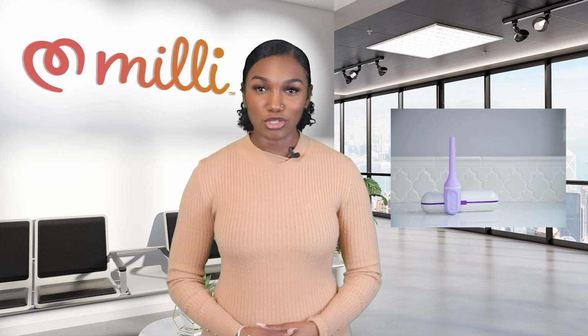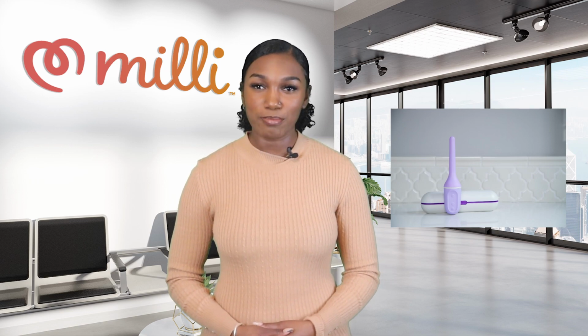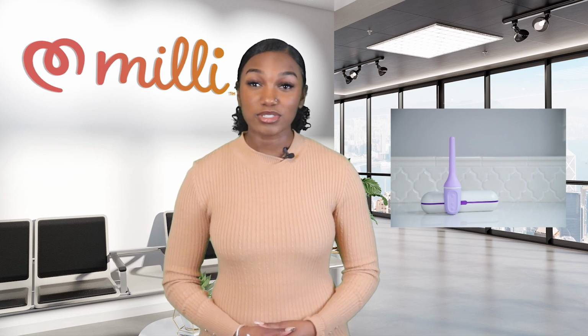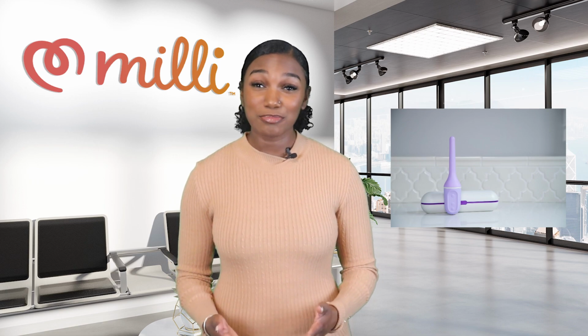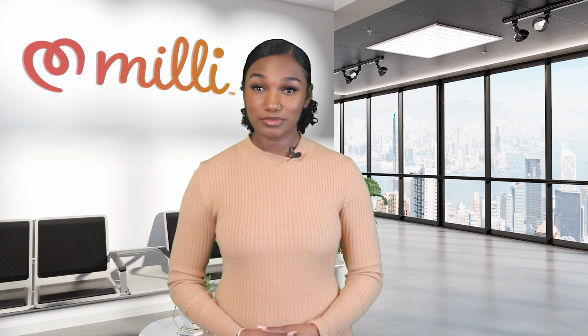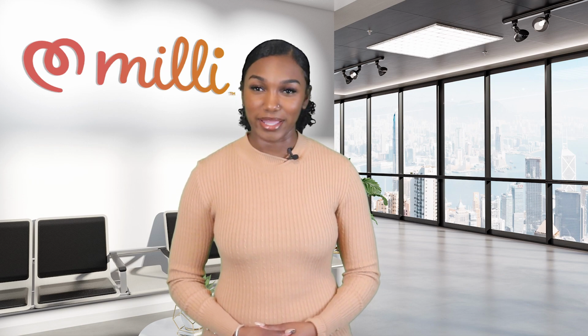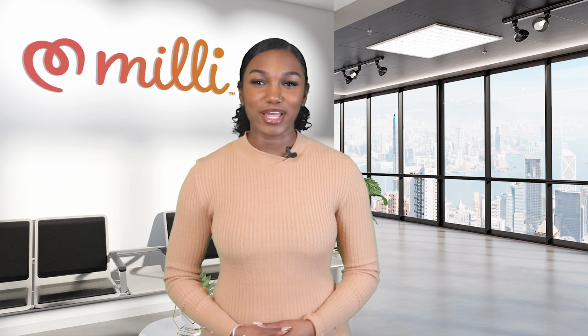The device is covered in soft silicone, so only water-based lubricants should be used, as silicone-based lubricants can deteriorate the silicone of the device. The four arms of the device are designed to stretch the pelvic floor muscles, but they could be damaged or break if the wand is twisted or bent. There are operating instructions in the Milli IFU, including a fairly general treatment plan. If your provider recommended a dilation routine designed to meet your specific health needs, please follow that treatment plan.